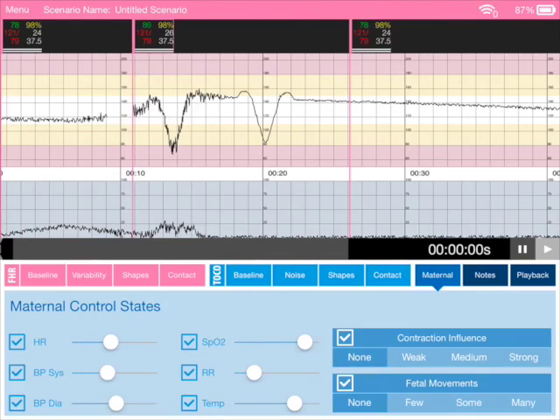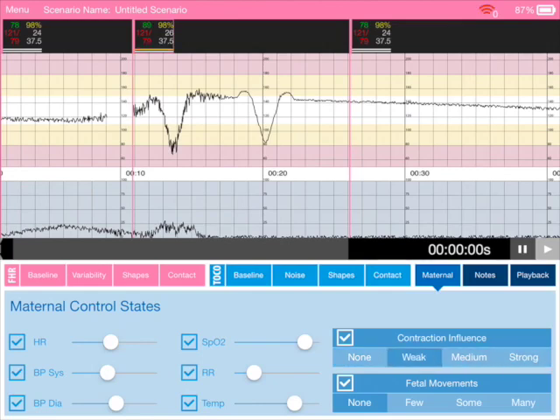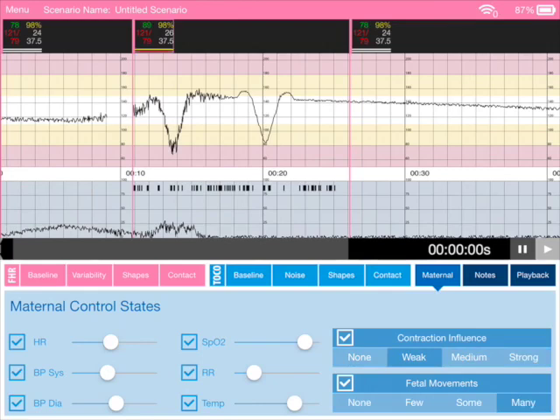And as a contraction comes along, you may want it to have a strong influence on the heart rate or a medium or a weak influence. We can add in fetal movements as well by just doing that.